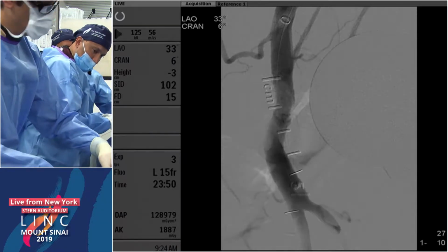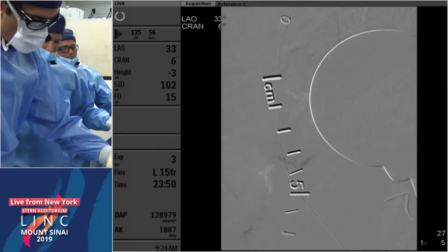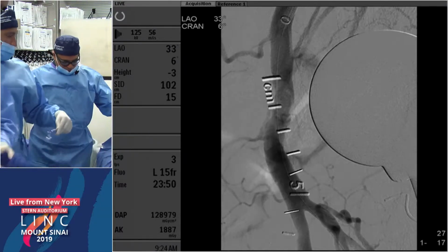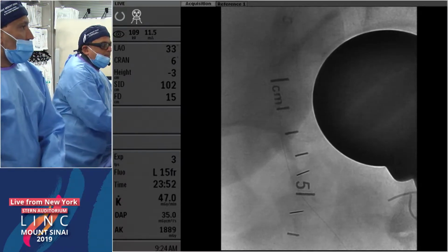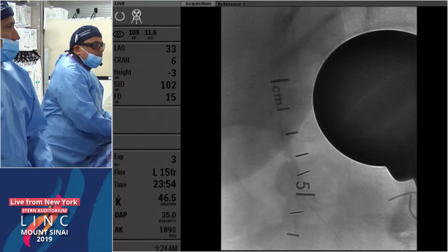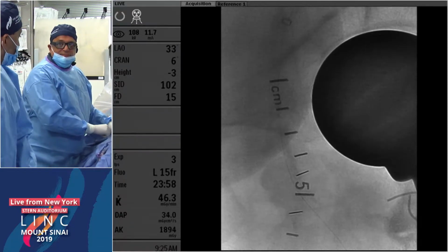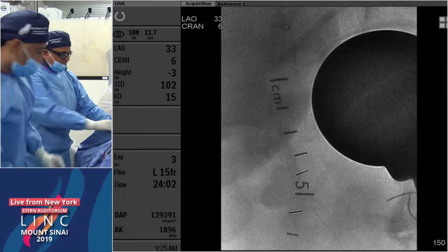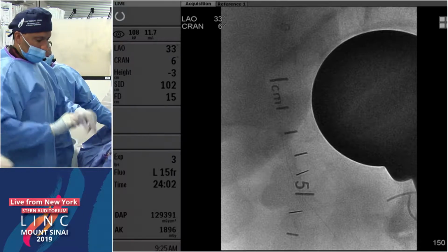If the bifurcation is involved, placing a scaffold is many times not possible, or there are a lot of arguments why we should not want to have metal here. But here, very clearly, the only limitation I see is the limited size matrix of the Supera over here. But other than that, to me, that's a straightforward stent case.